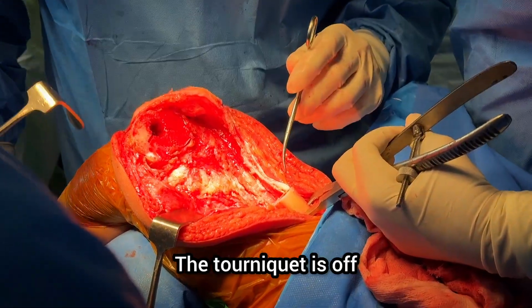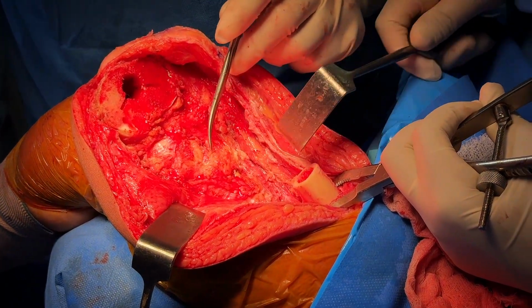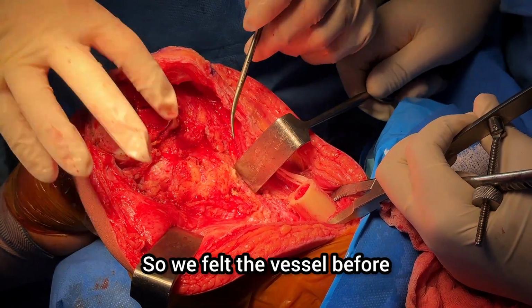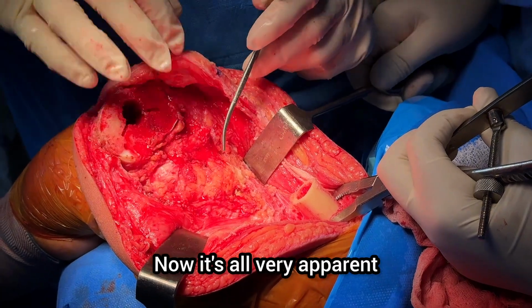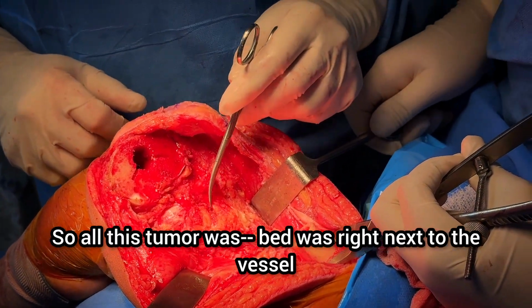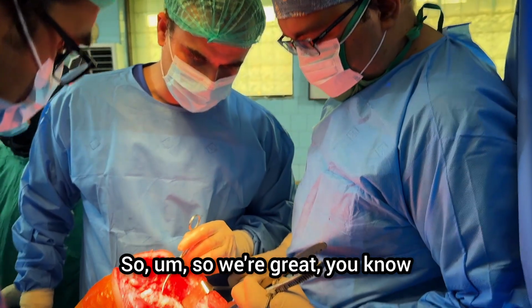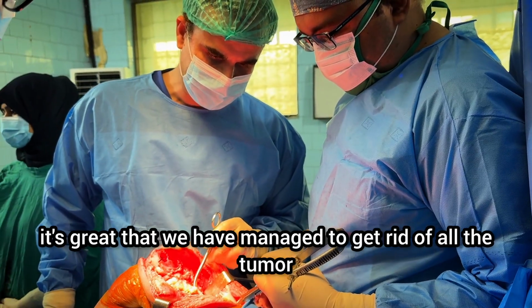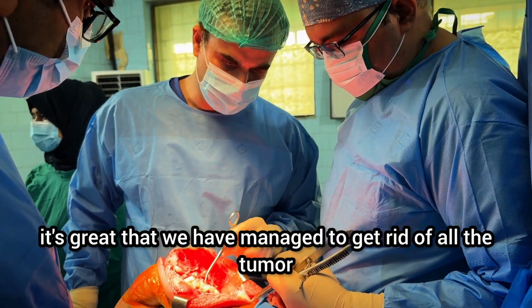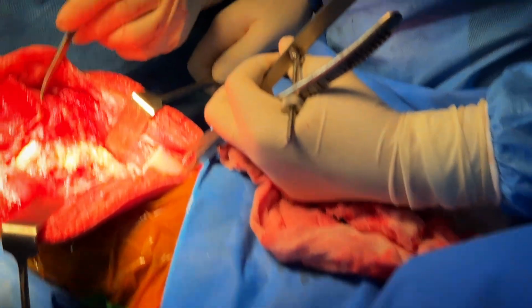The tourniquet is off. We've cleaned everything again. You can see here now how close we're operating. We felt the vessel before, now it's all very apparent. All this tumor bed was right next to the vessel, almost encompassing it from this side. It's great that we have managed to get rid of all the tumor, and the vessel we've confirmed is intact. But this is how we operate.